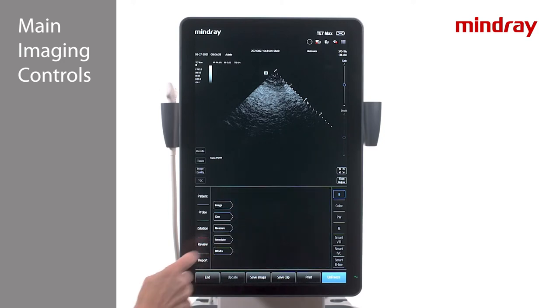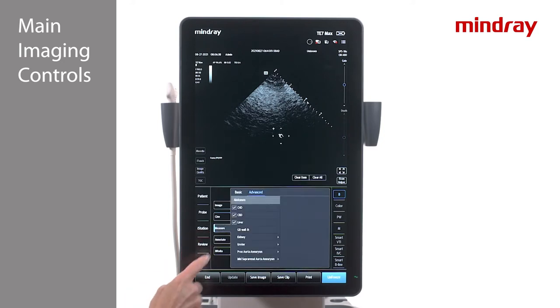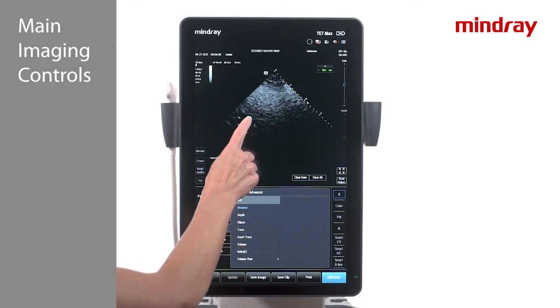Measurements on the TE7 are divided into two types: basic and advanced. Basic measurements are generic calculations like distance, area, and volume. Under the advanced tab is where the labeled measurements specific to the exam mode are located, such as crown rump length in OB or ejection fraction in cardiac. To take a basic distance measurement, freeze the image and press the measure tab in the lower section of the touch screen. A hand shape icon will appear on the screen.